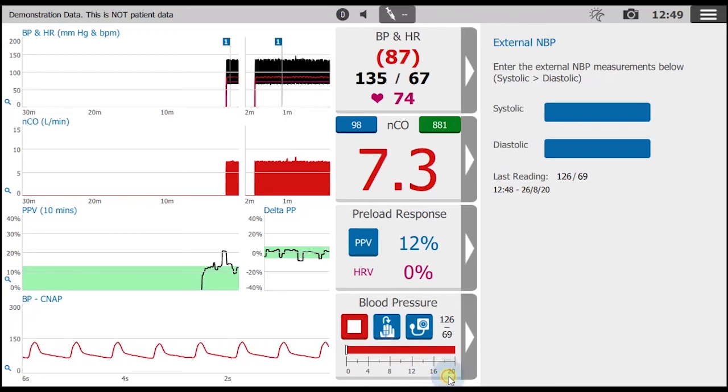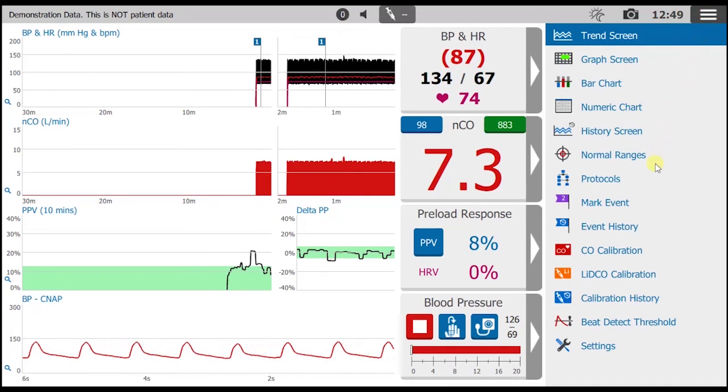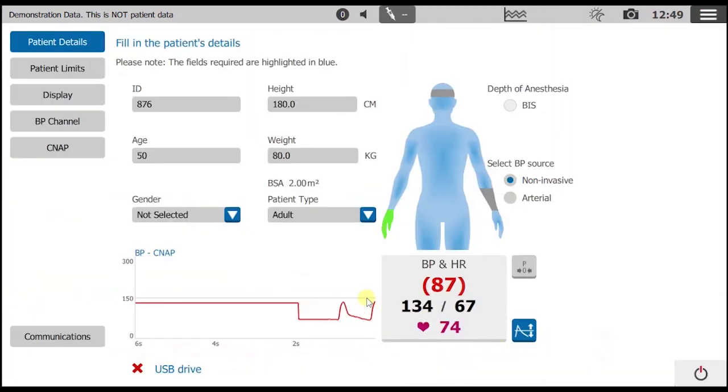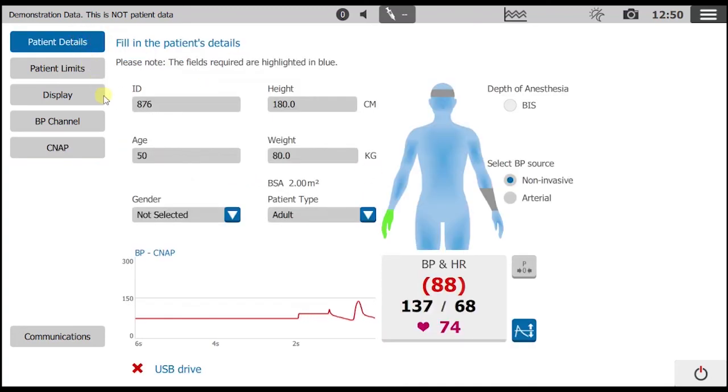In summary, clinicians can easily obtain continuous blood pressures and advanced hemodynamic values 100% non-invasively. It's easy to do with LIDCO, there are no disposables, and the information provided can help guide clinical decision making. If an arterial line is inserted down the road, the transition is seamless.